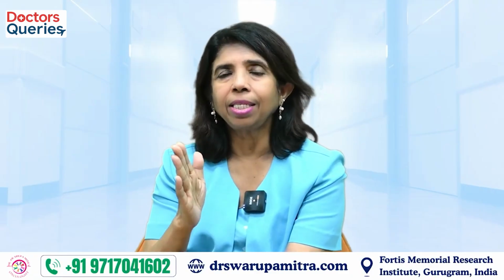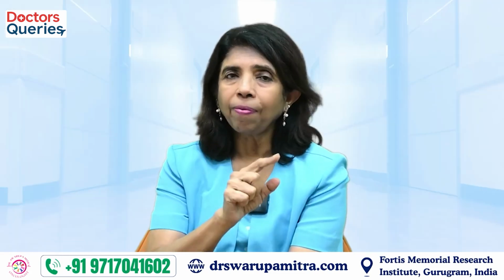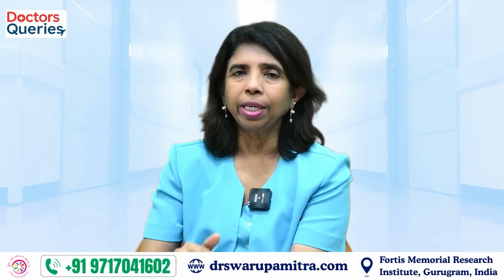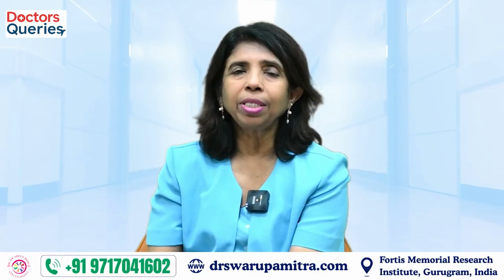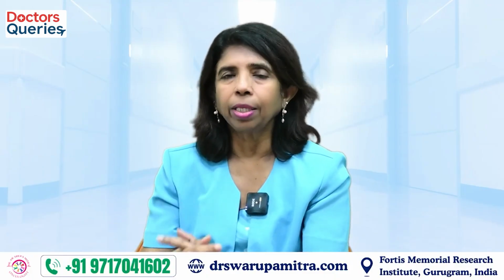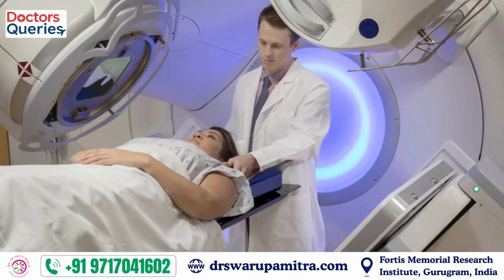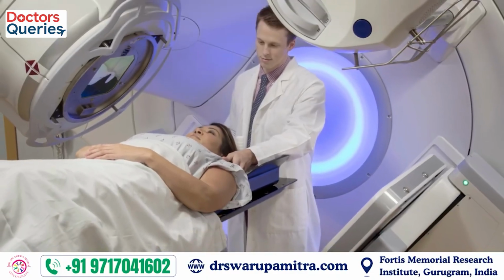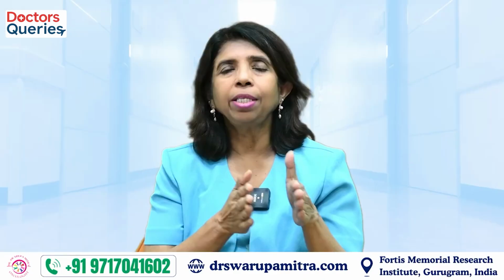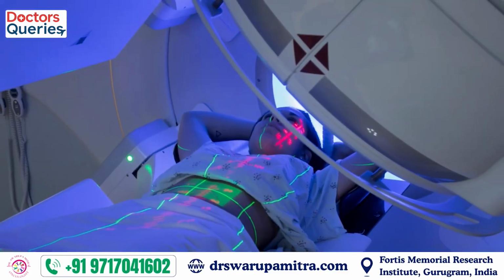So, the second step is the radiation planning, which is done a few days after the first counseling. The day the patient is called for radiation planning, we tell the patient that it will require about 1 or 2 hours in the hospital. This is the time when we call the patient. The patient lies on a simulator. A simulator is a machine which looks like the treatment machine. It is on this machine that we take the image of the patient in the treatment position.